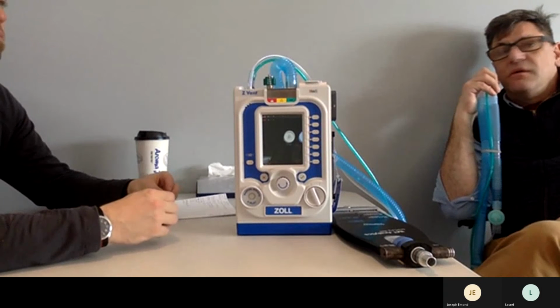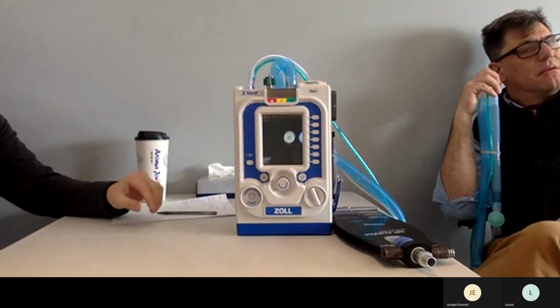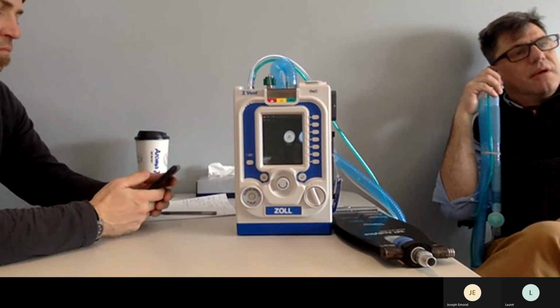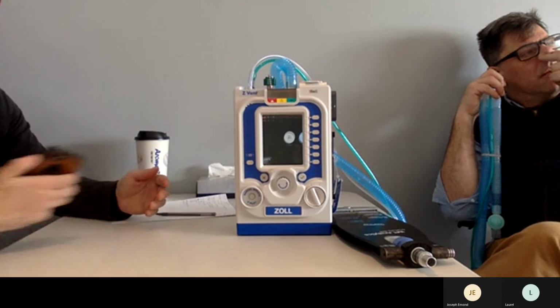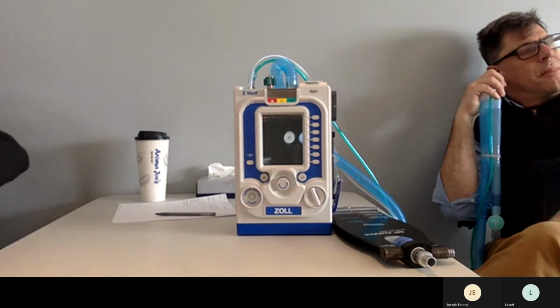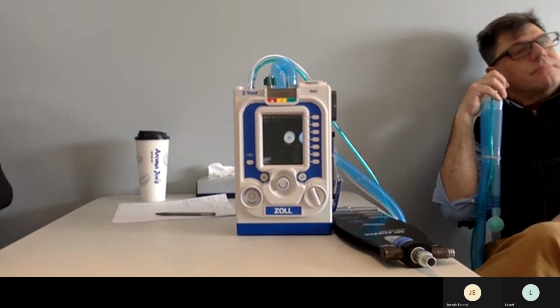Yeah, with that CPAP, we were getting screwy numbers. And we were like, what are we doing? And we looked, and in the package it said not accurate over 5 liters of oxygen flow. We're like, there you go. Was that an inline or was that nasal cannula? That's a cannula one. So you were trying to put the nasal cannula on and then put the mask over that, and you wanted to reverse that by putting an inline between the mask and the tube, just like you would with an ET tube.